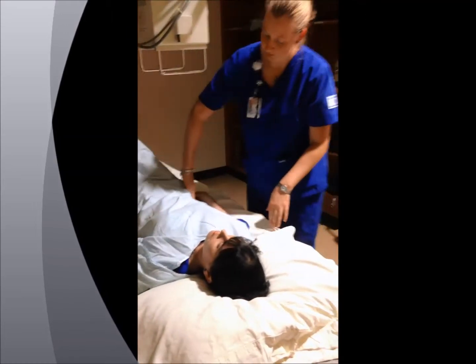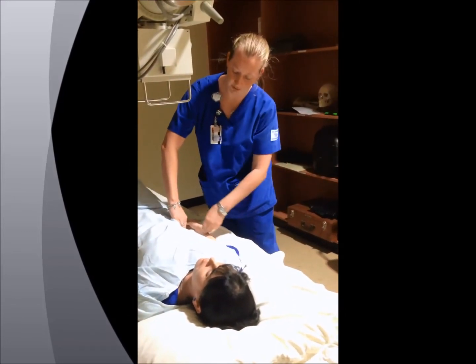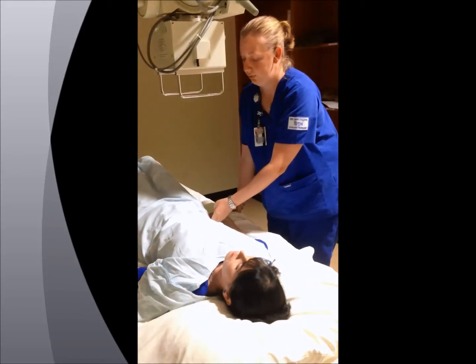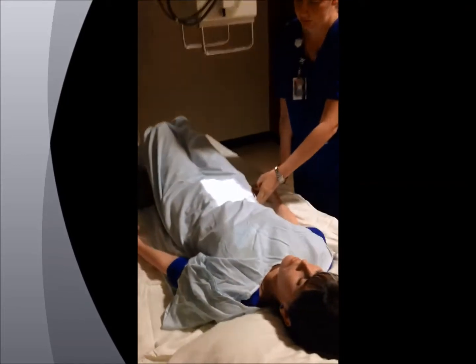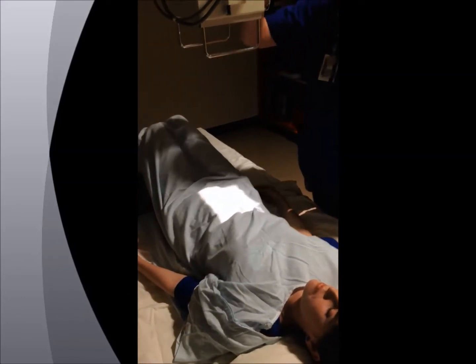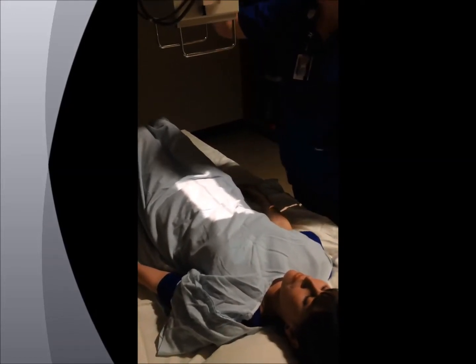You're going to feel your hip, if that's okay, ma'am. Always ask for consent, and you're going to feel for the iliac crest, and you're going to center the tube, central ray, to the crest at midline. And you're going to open your collimation, four-sided collimation, top to bottom, and close in on the sides.